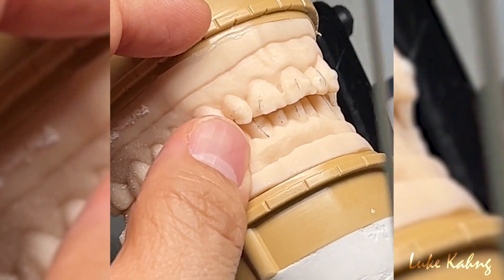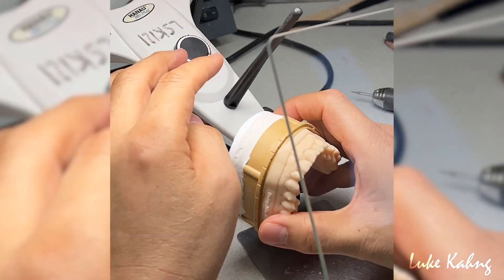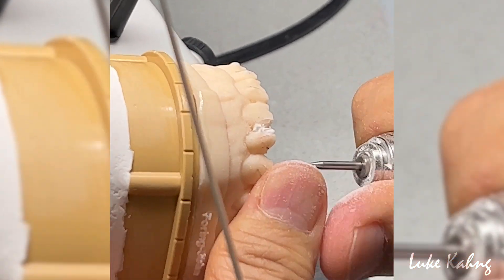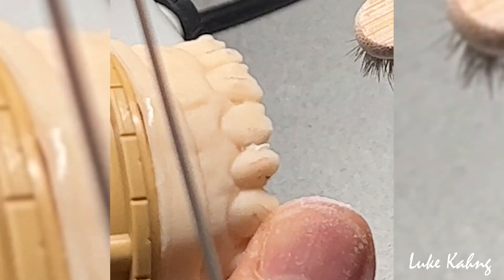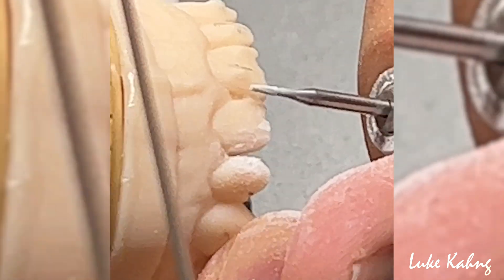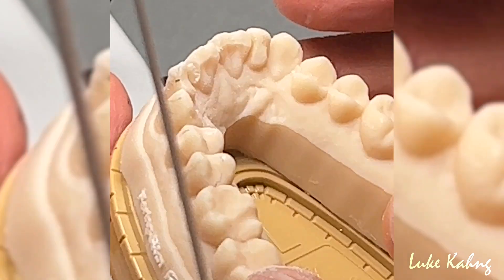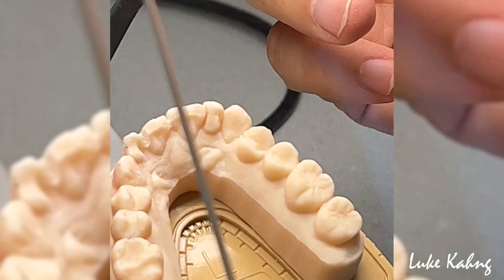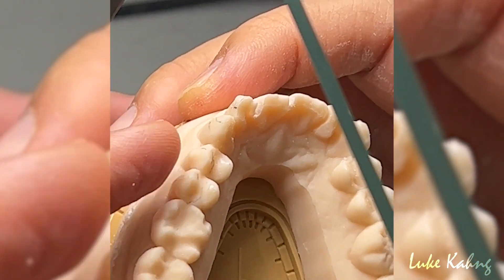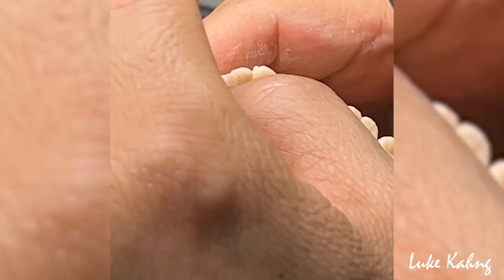So I have to create more here, so the lateral will get better proportion. I have to grind more the distal area, so we can correct it like this. We're going to make the 16 temporalization. Looks like I have to make 6 unit and then probably 2 unit here. You see out and in — I have to grind a little bit more here. And then 2 unit, 2 unit.